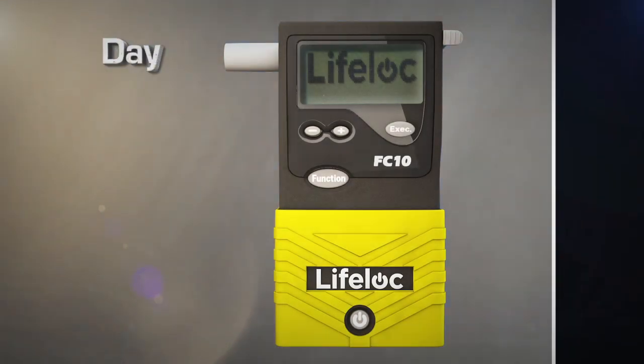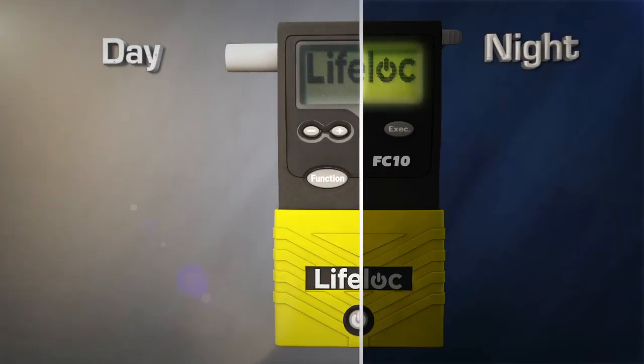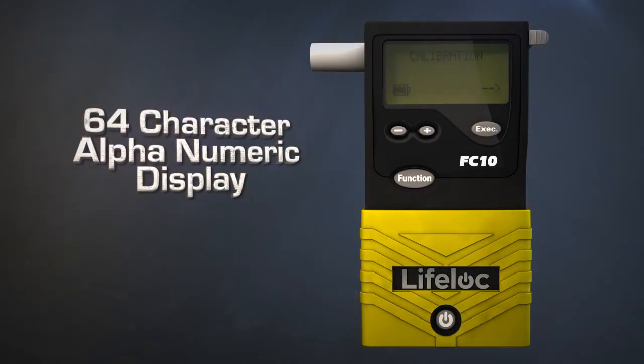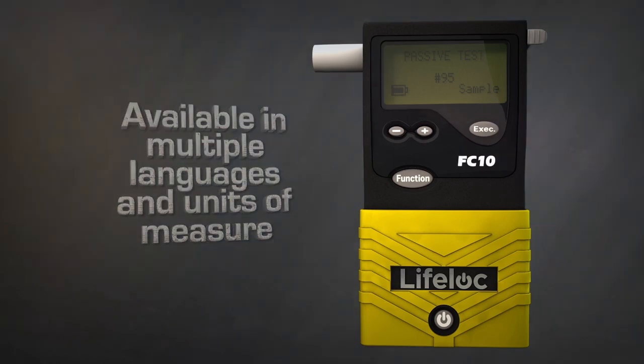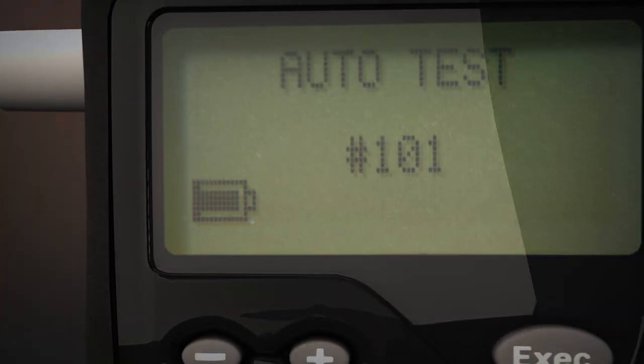Standard features across all models include a backlit LCD for excellent day or night visibility, a 64-character alphanumeric display that communicates with the user providing easy-to-understand operator prompts and full text alerts. Icons are used to indicate battery life, printing, and other prompts, eliminating operator interpretation.